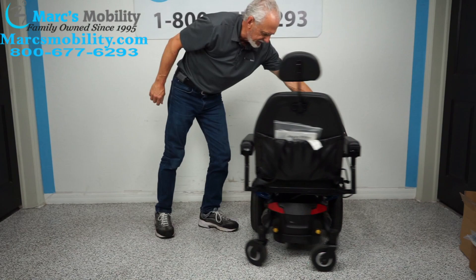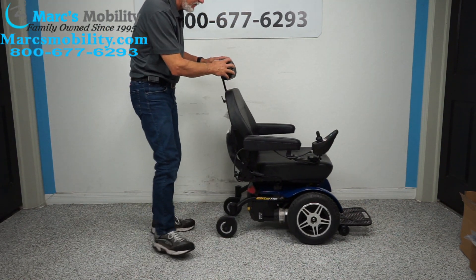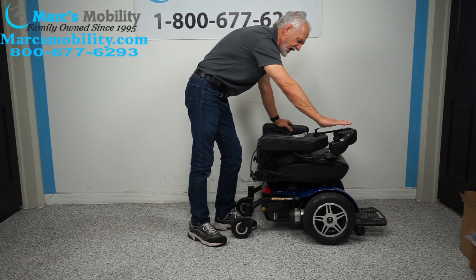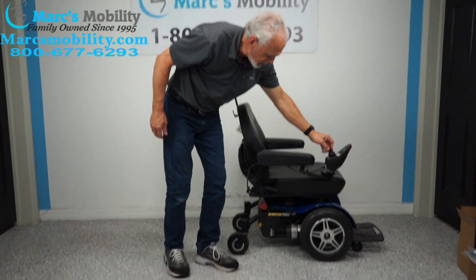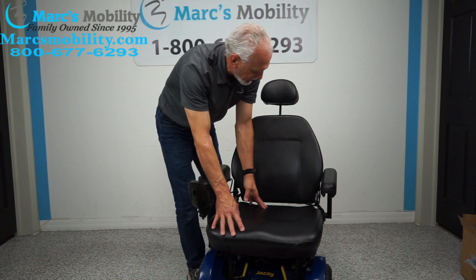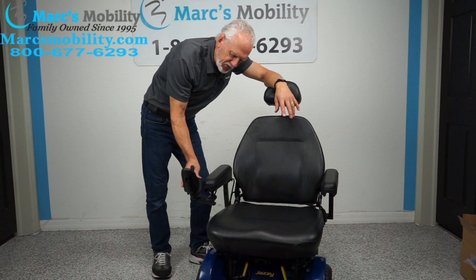The seat on this chair is a captain's seat, which means you're going to have a headrest, a knob to adjust the seat back, and the seat folds down for transport. The highest point when folded is about 31 inches. The seat dimensions are 21 by 21. The arms flip up, the joystick is on the right but can be moved to the left side. It's a swing-away joystick so it swings away from the front so you can get closer to your dining table.